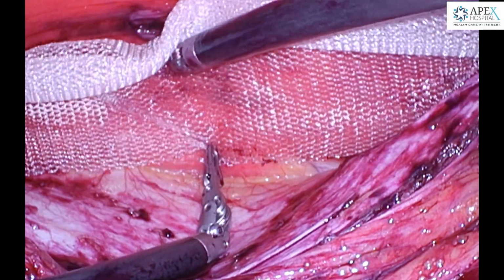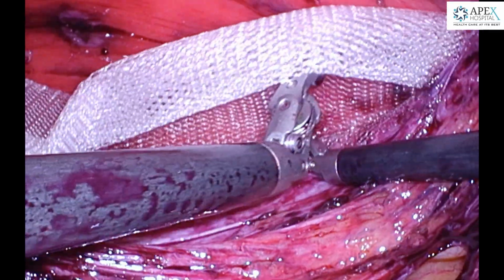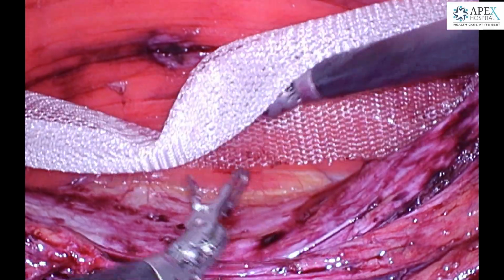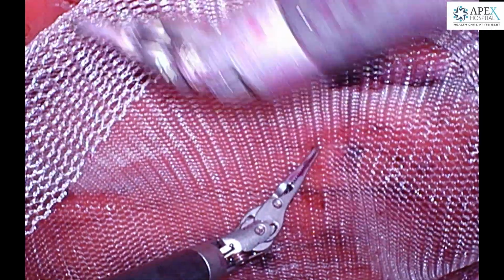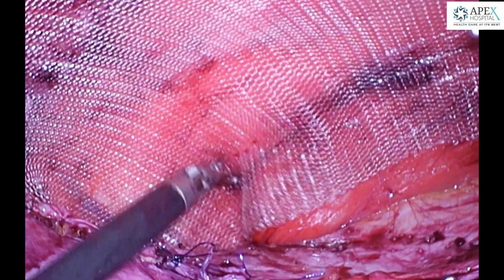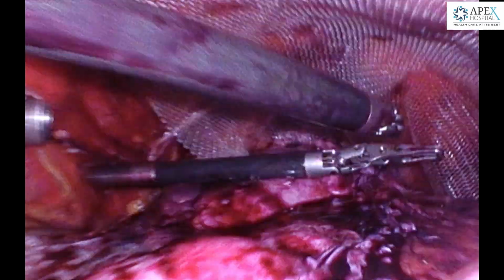A 20 by 15 centimeter medium weight macroporous polypropylene mesh is inserted and slowly spread so that it lies flat on the surface. This is confirmed by taking out the camera from this port and putting it through the accessory port so that we can look at the lateral margins of the mesh which are lying flat.